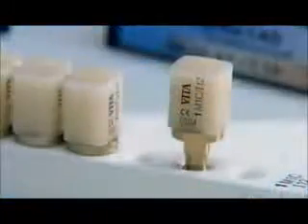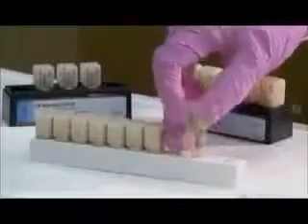He downloads the image of the bite impression and then superimposes the images as he designs a custom dental inlay digitally. The dental assistant selects a glass ceramic block of the appropriate size and color. She anchors the block in a milling chamber and shuts the lid. Two computerized drills now sculpt the block into the dental inlay, guided by the digitally produced design. This process takes less than 10 minutes.